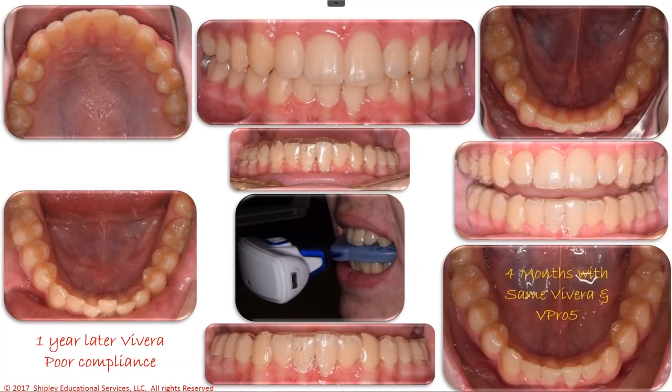Here he is 4 months later. I saw him once in between to add some dimples on that tooth to help it come in just a little bit better. And after 4 months with the same Vivera retainer and with the V-Pro 5, we were able to get him back to where he started for only $200.